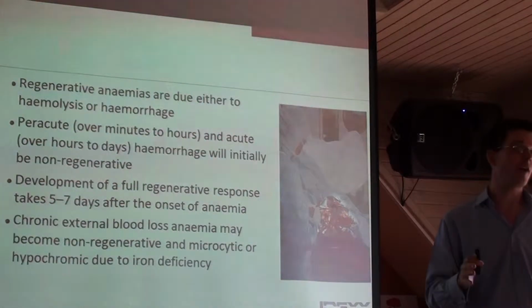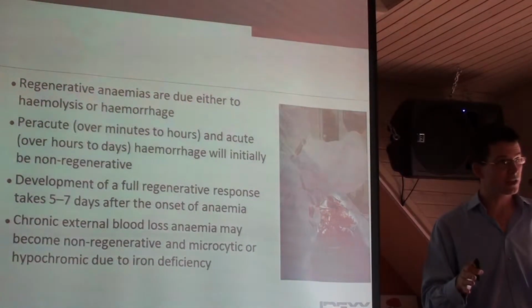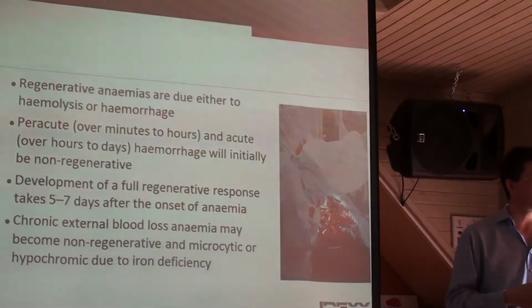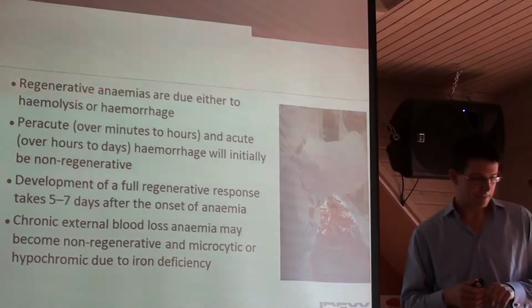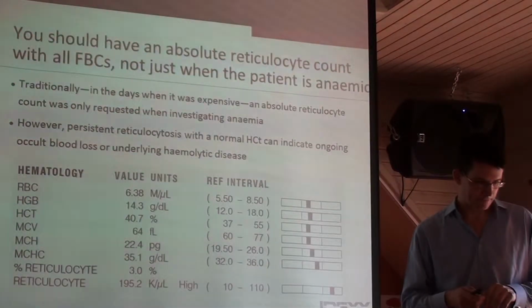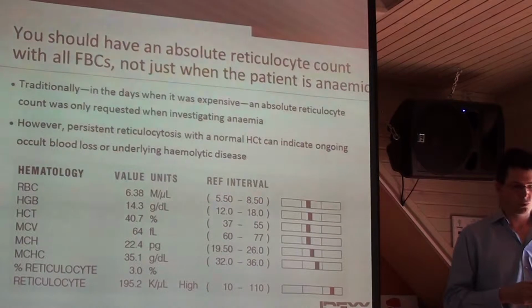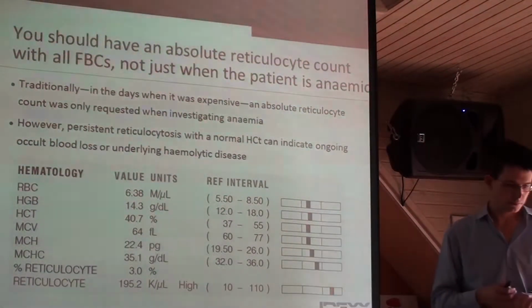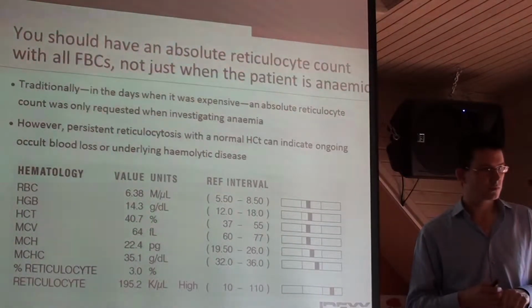Well, it takes about 5 to 7 days before you will see an increase in the number of reticulocytes. But remember, if you look at the graphical output, you may see those reticulocytes somewhat earlier.